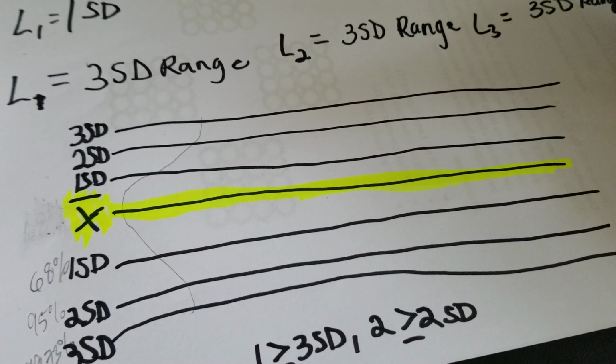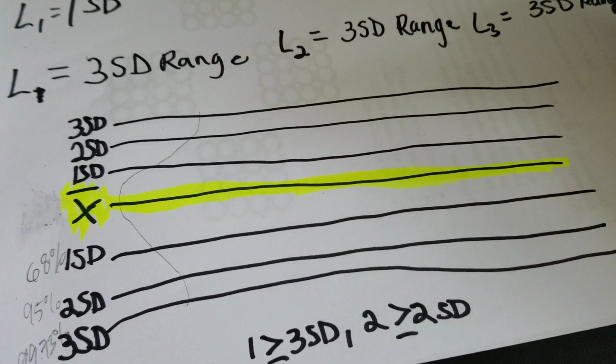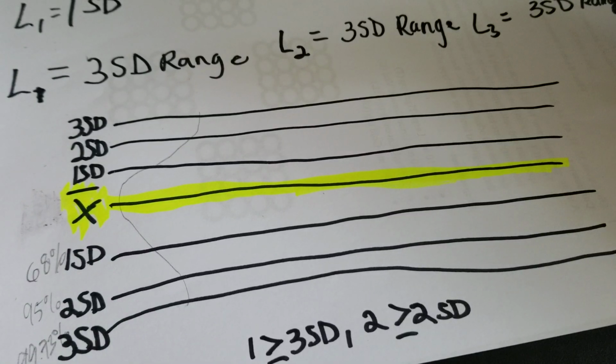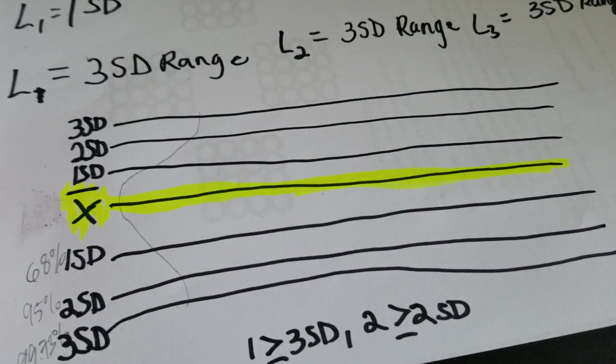Is it an instrument problem? Did we not calibrate that actual analyte's test? You know, we have to figure out what that is. So there is a whole slew of steps that you need to follow in order to make sure that you're bringing QC into control if it was out at some point.